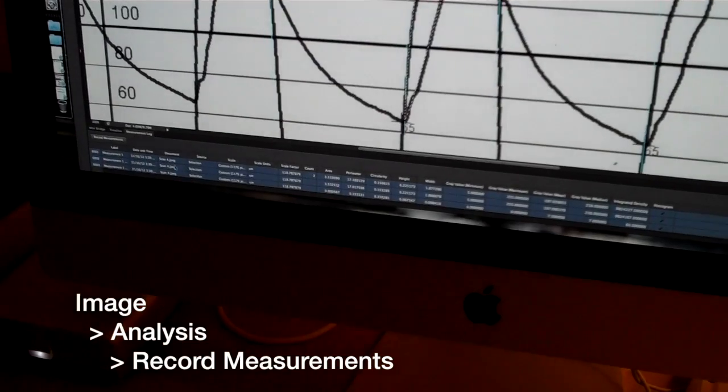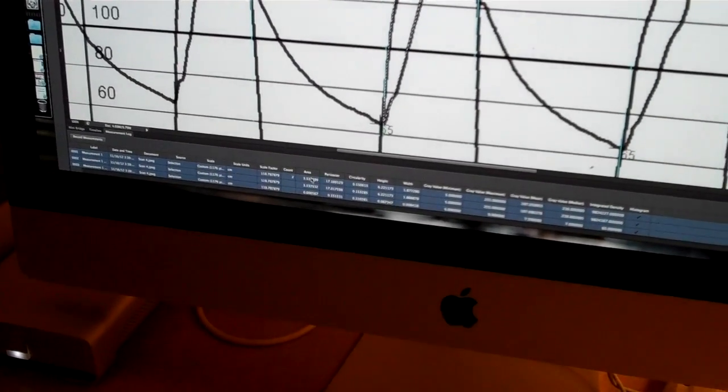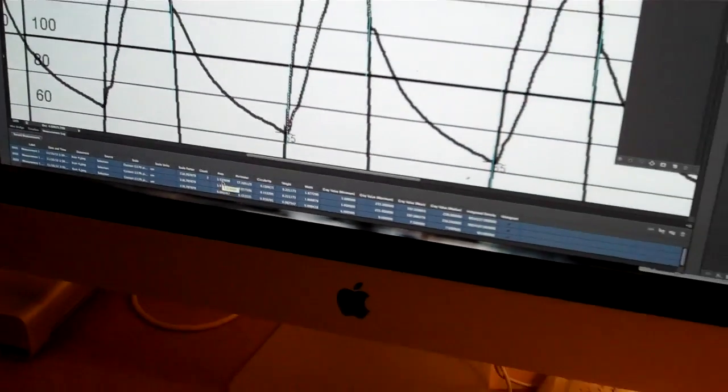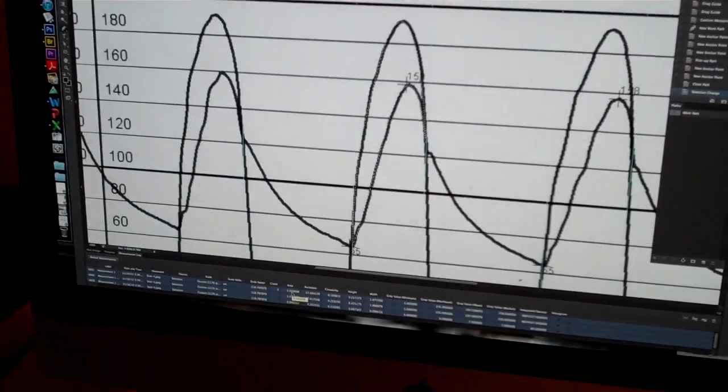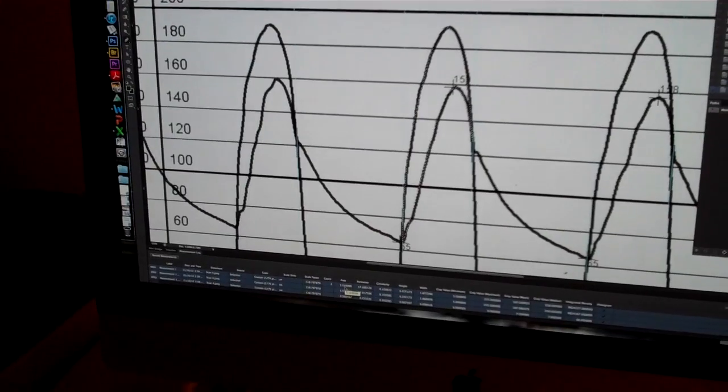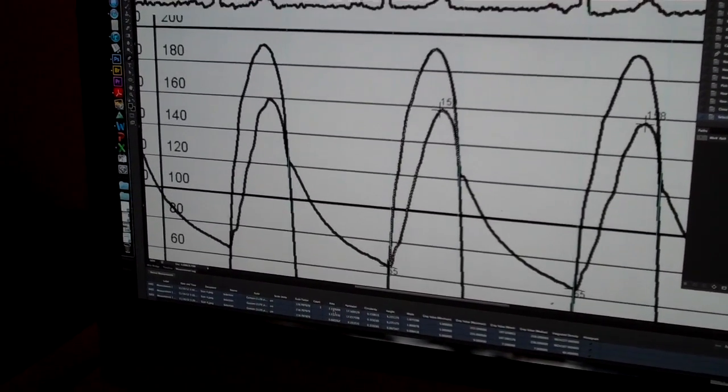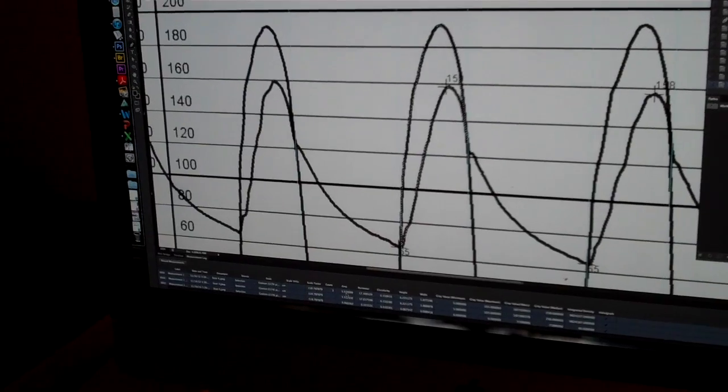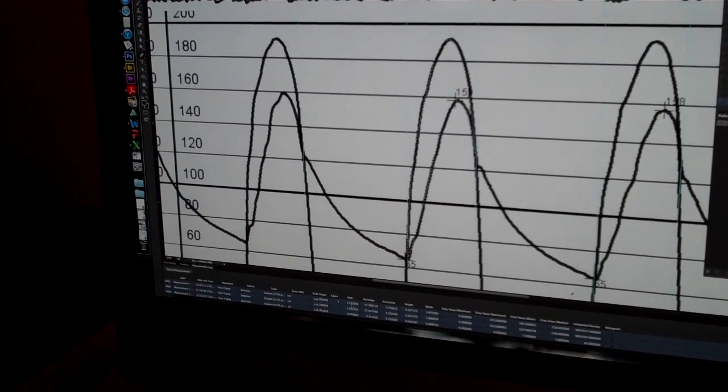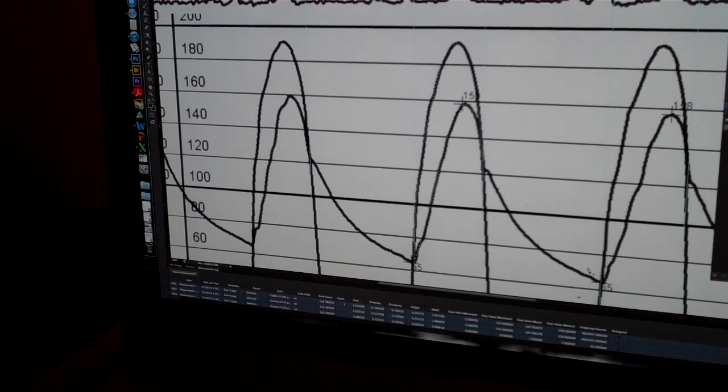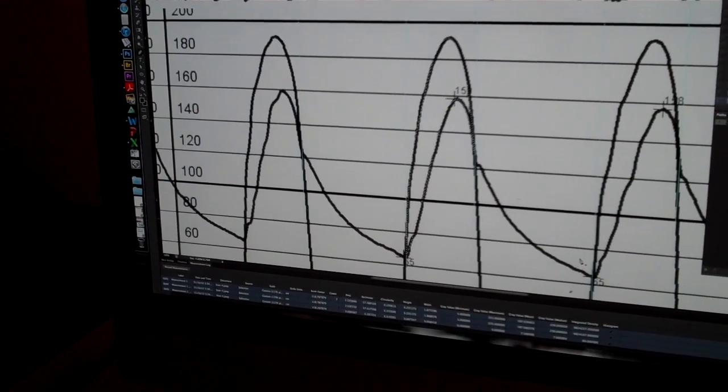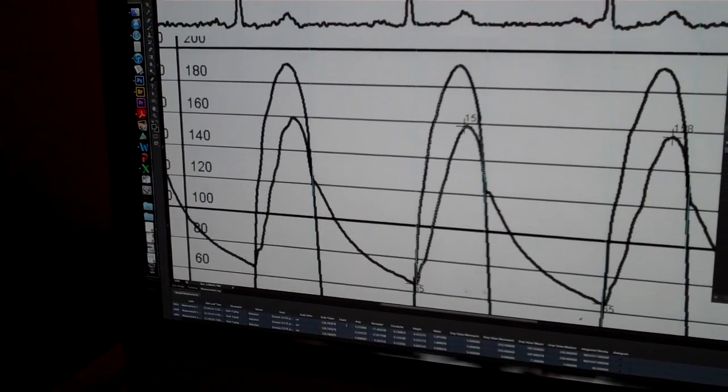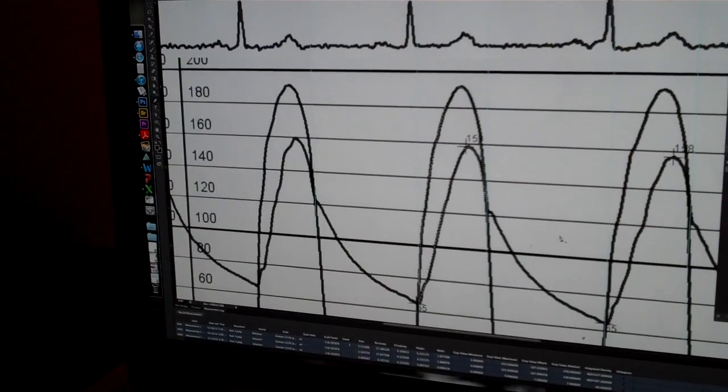So now you see the usual Photoshop marching ants around here. And so I want to measure the area subtended by these marching ants. So I'll go back to image, analysis, record measurements. The keyboard equivalent for this is shift command M. So I click on that. And this first measurement here, the area is 3.53. So 3.5 square centimeters. I'm only going to use two digit accuracy because there's other measurements in this thing, mainly the cardiac output, that are not accurate to more than really two digits.